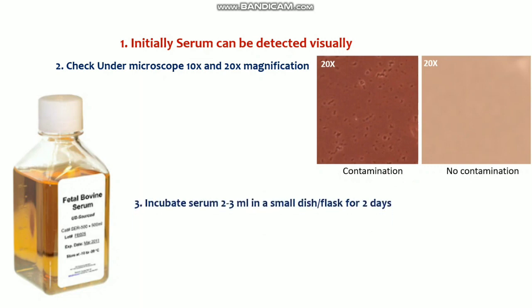Number 3, this is a very important step, and you can understand it very clearly. Incubate 2 to 3 ml of your media or serum in a small dish or flask for 2 to 3 days. After 2 to 3 days, if you see turbid serum, that indicates contamination inside. If you see this kind of contaminated serum, then just discard it.